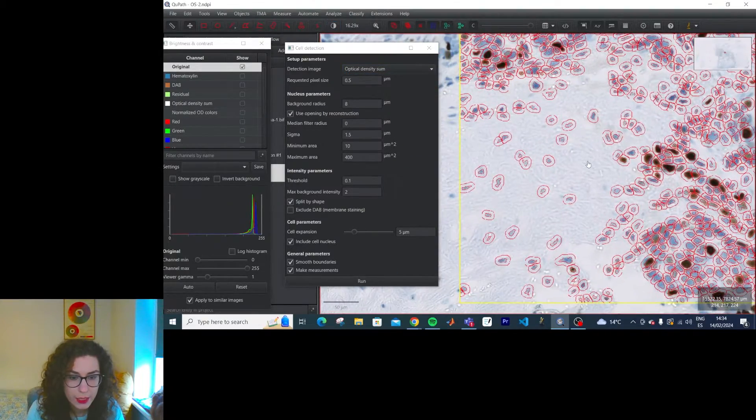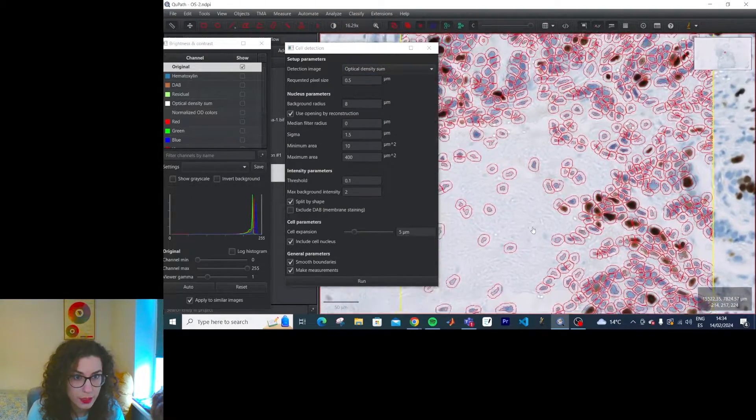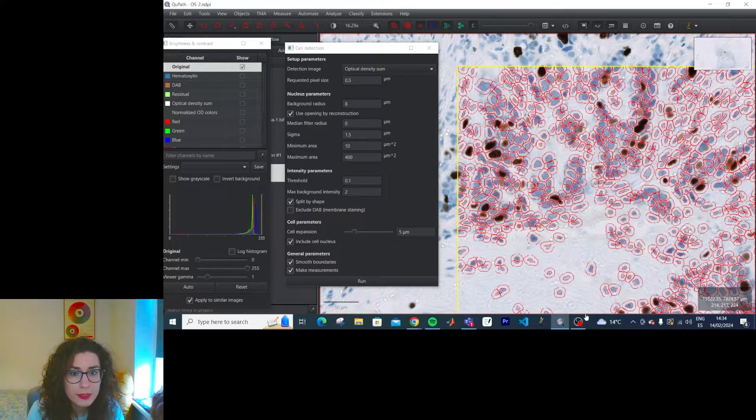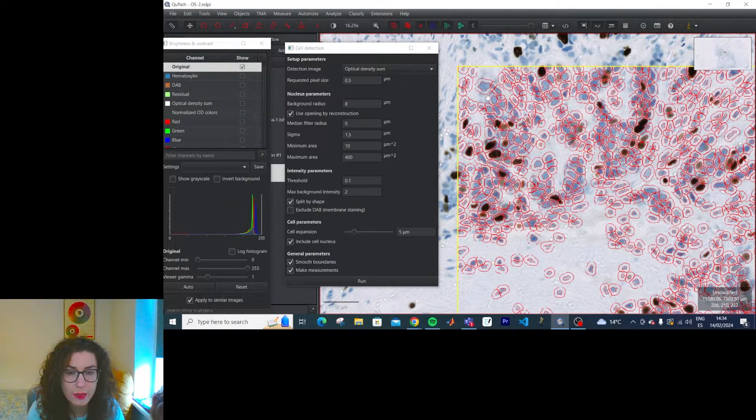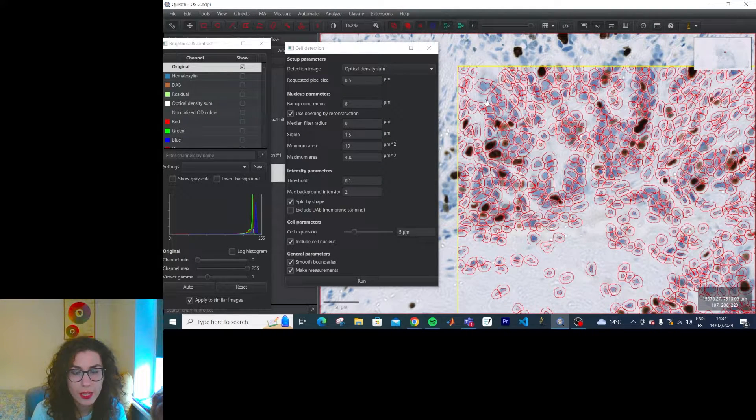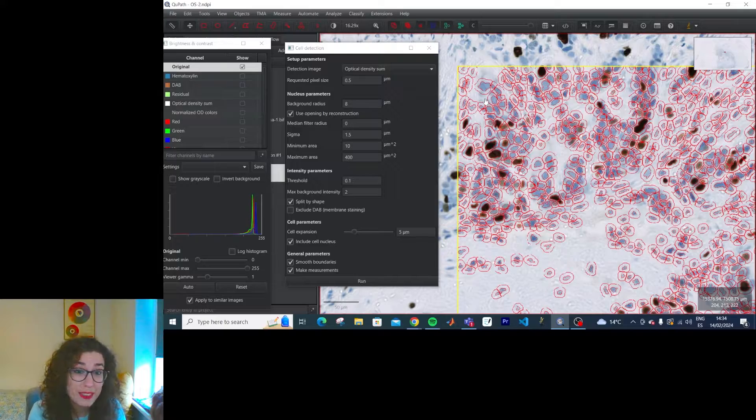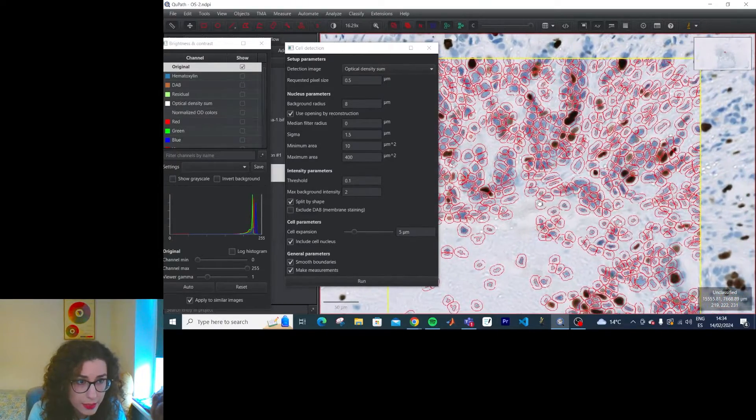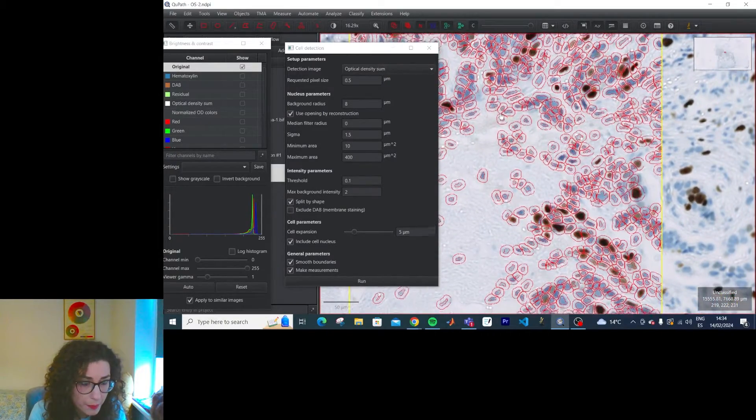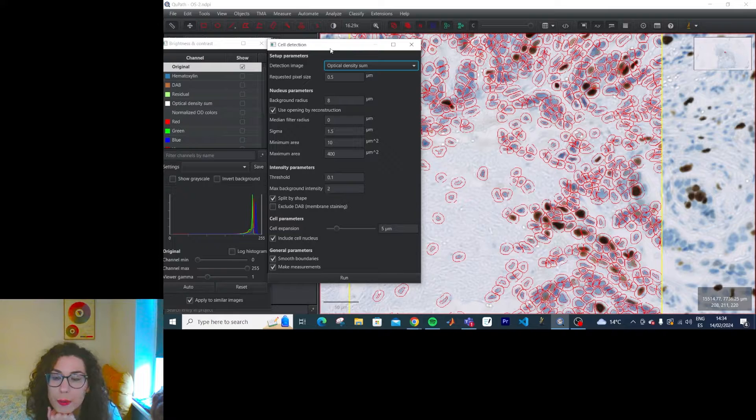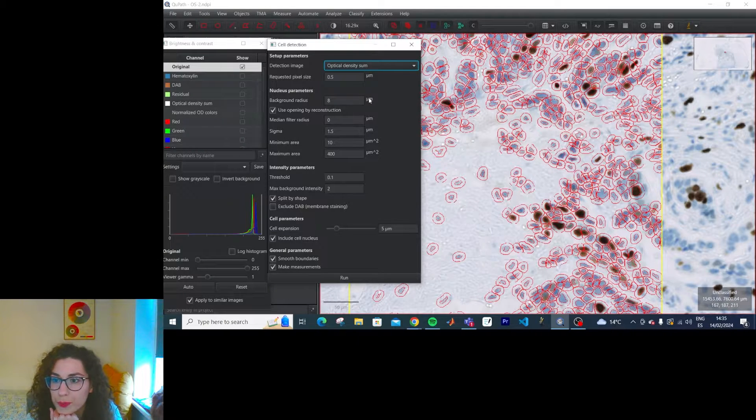And it is detecting most of these cells missing a few ones here. The ones where staining is very desaturated, but it is detecting most of them. What did these parameters do?